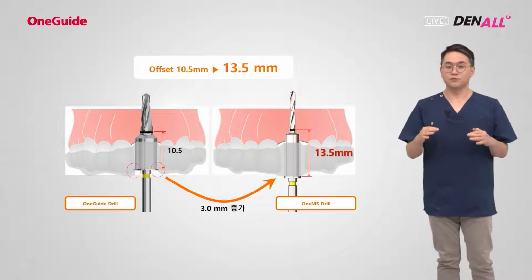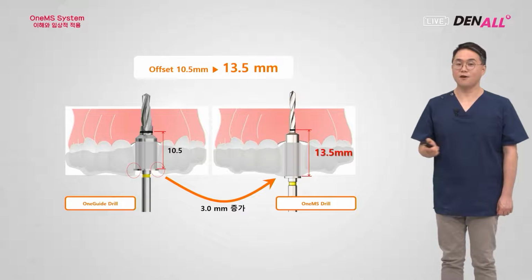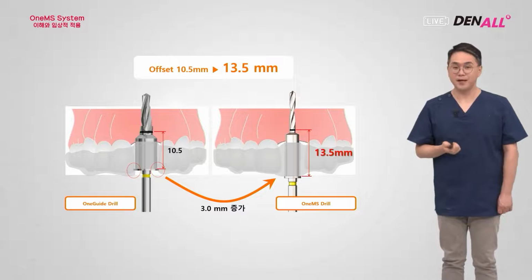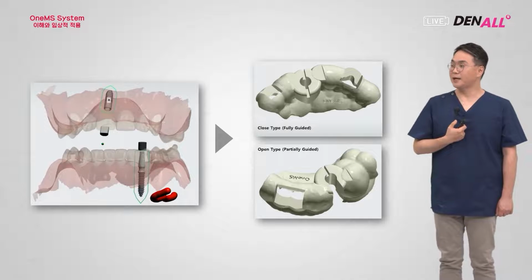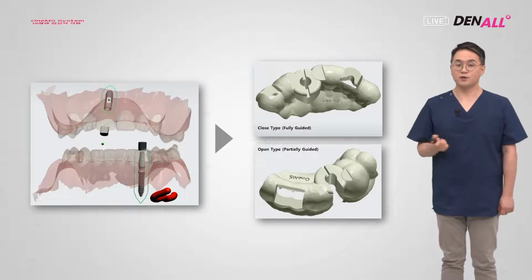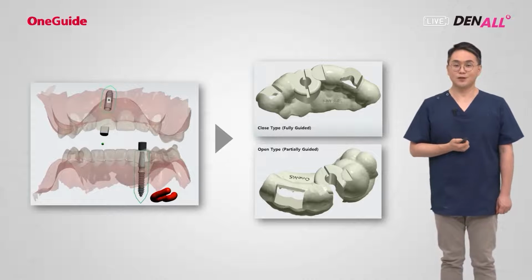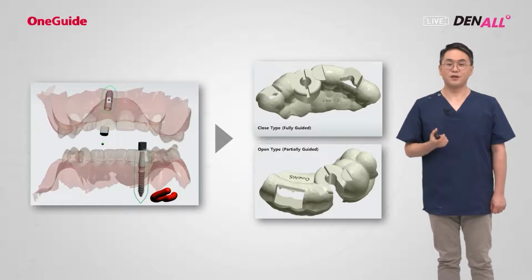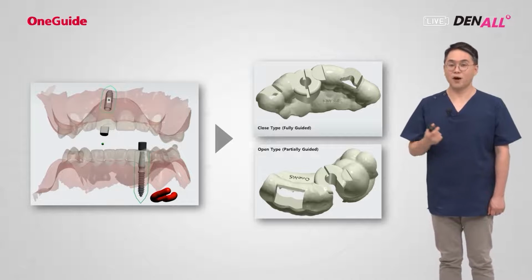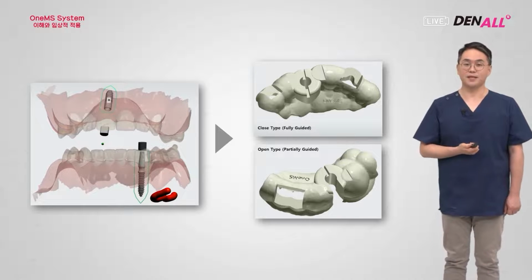On the lower anterior part, gingival recession or vertical bone resorption often happens, and the crown becomes longer. In such cases, the guide barrel drill is extended, and the offset is also extended to avoid interference. And also, the library itself for the MS implant and the 3.0 TS3 implant is in the implant studio, so also in the OneMS system. So the guide hole can be matched in the planning. So you don't really have to worry much. Just tell the digital center that you're going to use the OneMS implant here, then the guide template for this OneMS kit will be made and delivered to you.